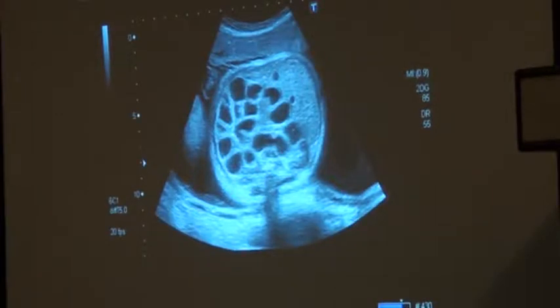This formula will not work if there is an abnormality in the fetal abdomen, like large kidney, polycystic kidney, meconium cyst, or dilated bowels. This will go off. But you do pick up on B mode that there is a problem.